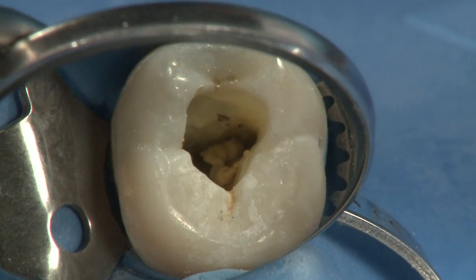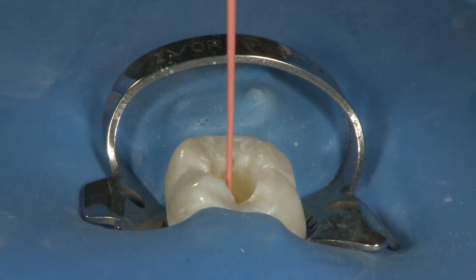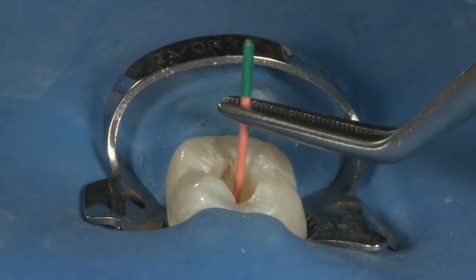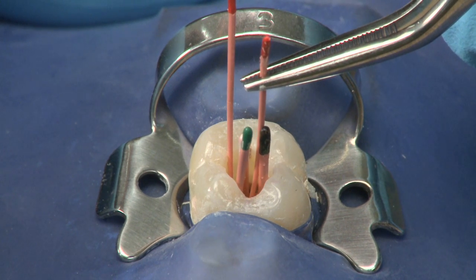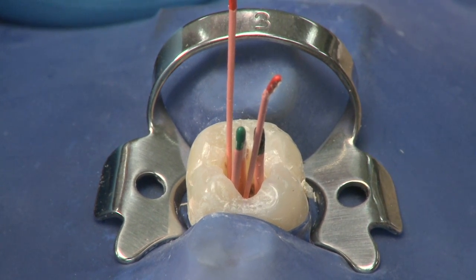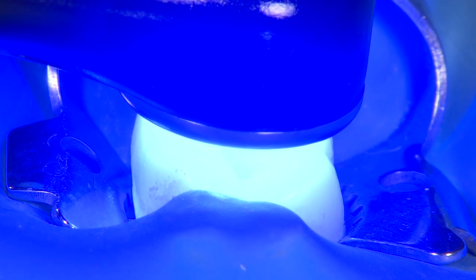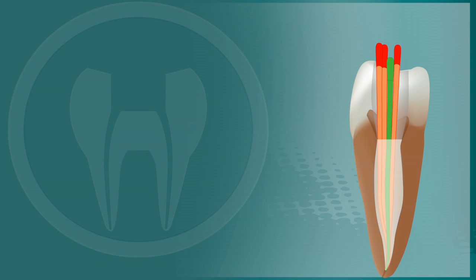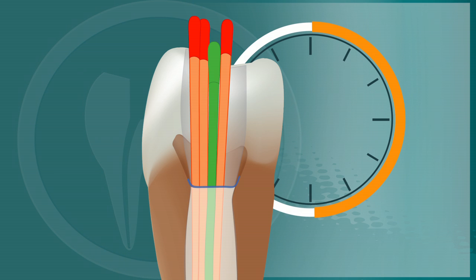At this point, you have up to 15 minutes of working time before the EndoRes begins to polymerize. Place your pre-fitted EndoRes master cone back into the canal and set it to the working length. If necessary, use an x-ray to confirm that the EndoRes point has been fully seated at the apex. Add additional number 25 accessory points into the canal to fill the open space. Once you have confirmation that your gutta percha is properly placed, light cure the surface of the EndoRes for 40 seconds. This will not fully polymerize the EndoRes in the canal, but create a thin crust of set material that will act to prevent an oxygen-inhibited layer from being present on the surface of the sealer. EndoRes should be completely polymerized in 30 minutes.